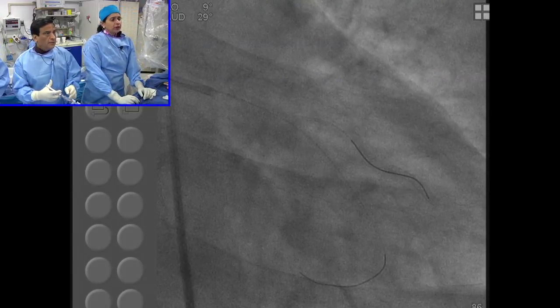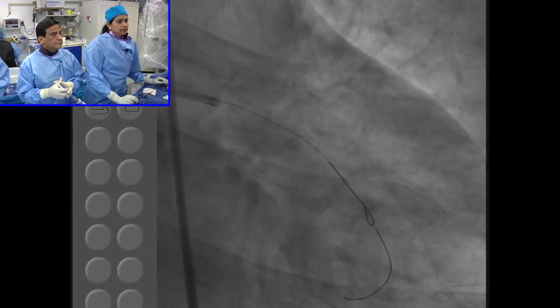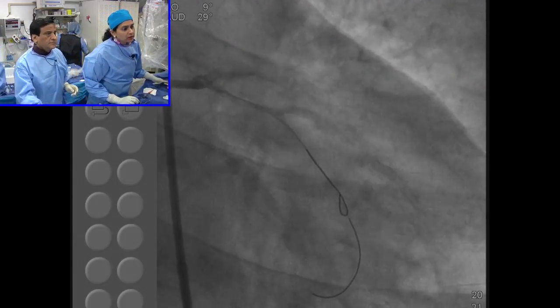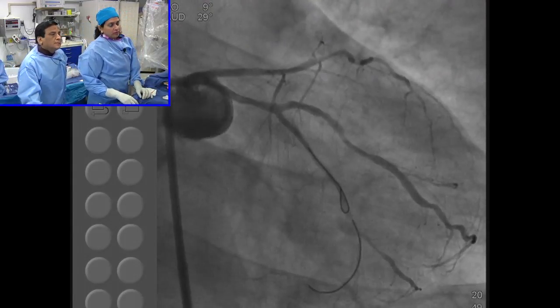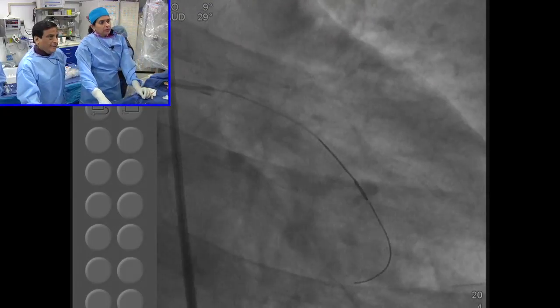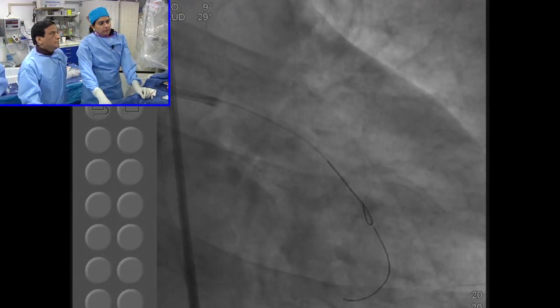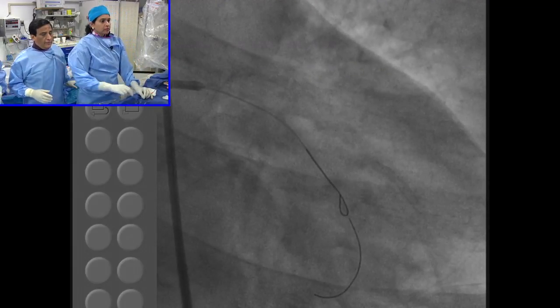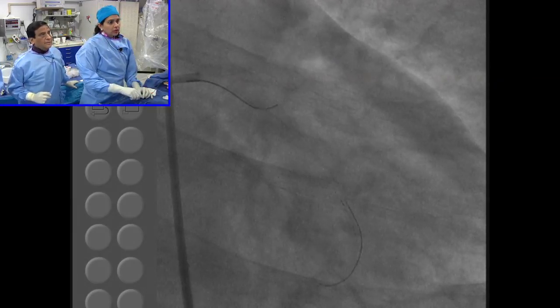No, I mean, if we think it's a pseudo lesion, the wire has come back now. That's okay. Pull back. Even I think distal, we need to cover it. Right. So if we need to cover, then should we put a 38 in the OM and then another long stent in the main vessel, rather than the OM1, because the initial plan was OM1 comes to the main vessel and we put a second stent in the distal vessel. I think that 38 will be too long. For the main vessel? No, the main vessel is short.